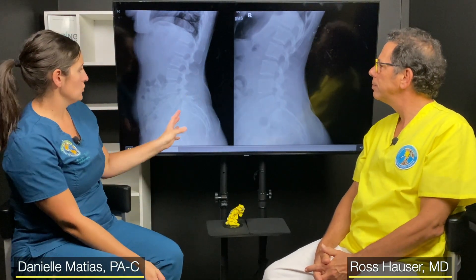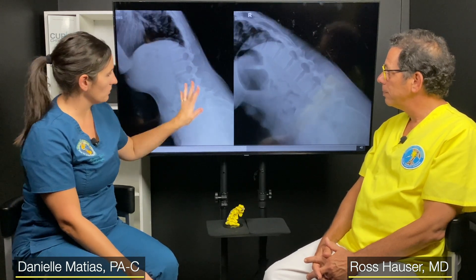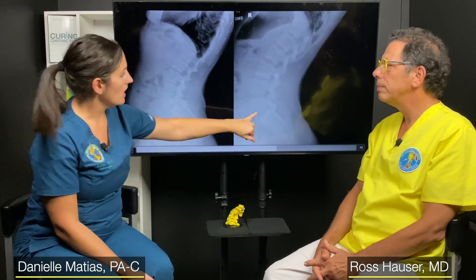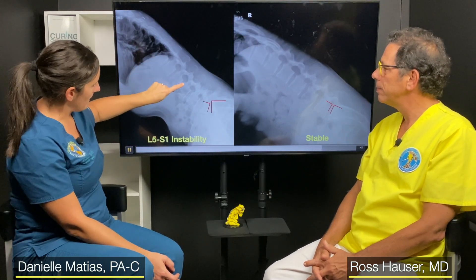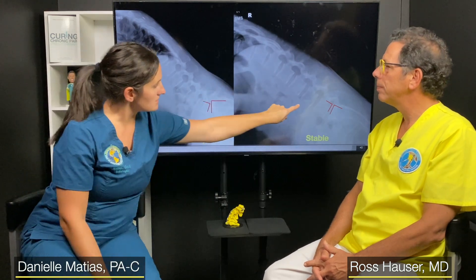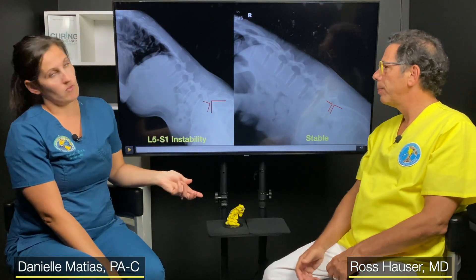This is an example of a motion x-ray on two different patients — one who has an unstable L5-S1 and one where it is completely stable. Here's L5, here's S1 — you can see it looks like a stair step where the vertebrae are not aligned. On a stable back, if you draw a line down the back of the vertebrae, they all line up together. That is how we determine if someone has instability on the motion x-ray.